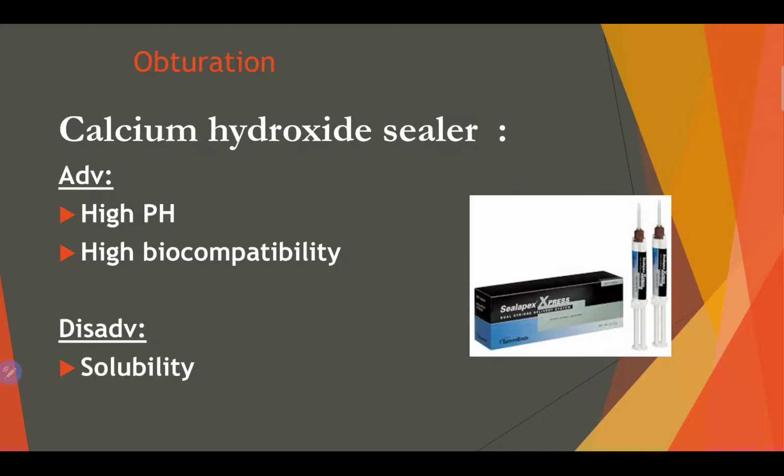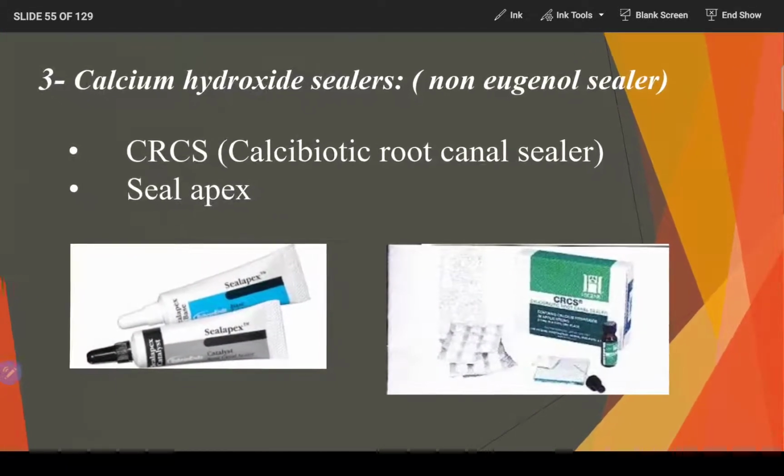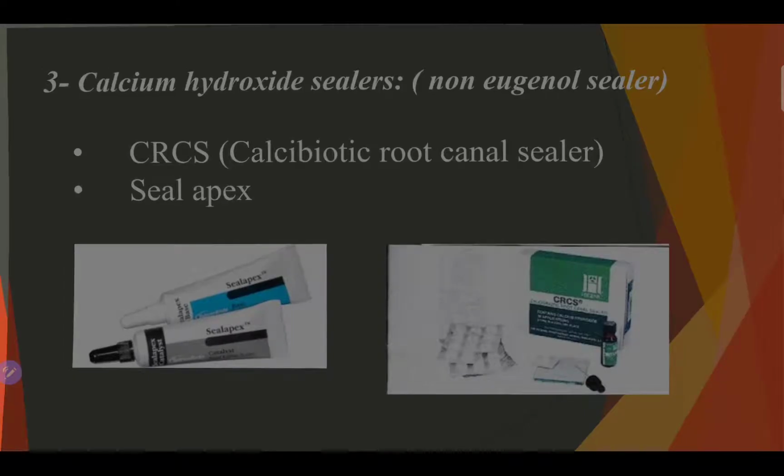Its advantages: high pH, so it's antibacterial, and highly biocompatible. It doesn't make any inflammatory reaction. But the disadvantage is its solubility. And look here, it comes in a paste form, not a powder and liquid form. Also the previous one comes in a paste form.